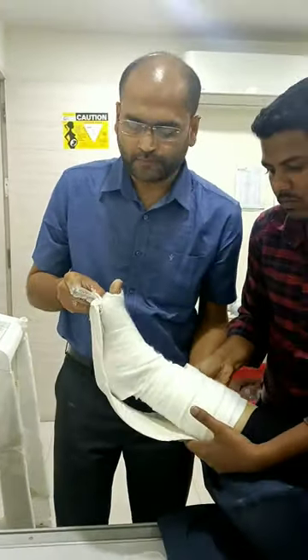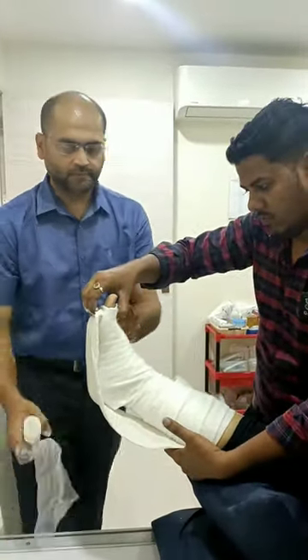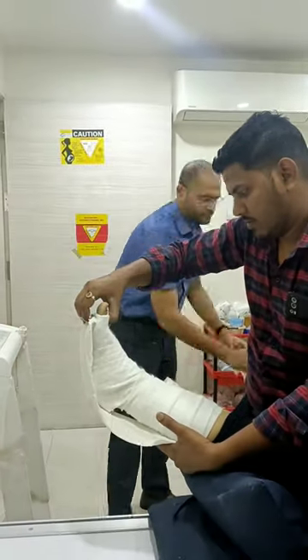Hello everyone, I am Dr. Pratik. In this video I am going to show below-knee slab application procedure for ankle sprain.